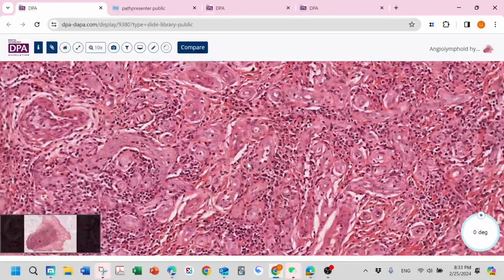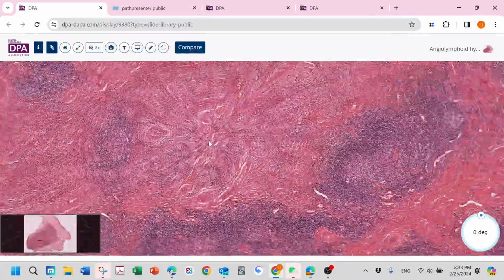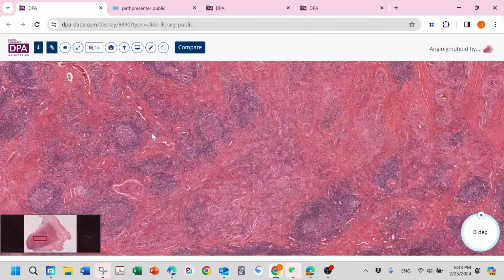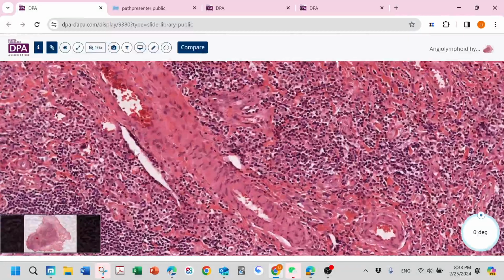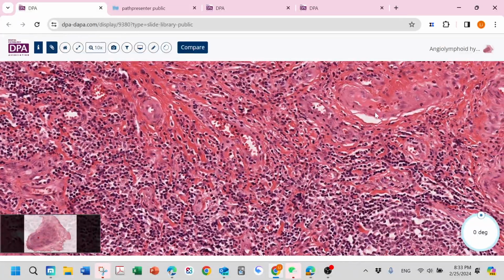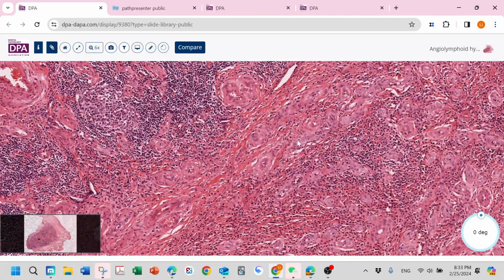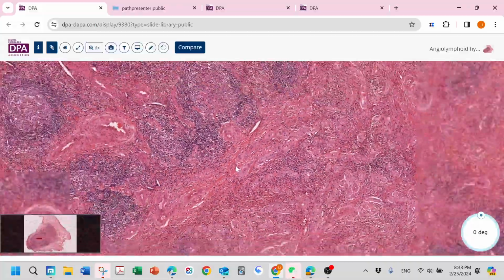So let's zoom in to find our friends, tons of eosinophils. Everywhere is red. And then a big vessel. And surrounding the big vessel, we have this plump endothelial cell proliferation everywhere. Endothelial cell proliferation with plump cytology: ALHE.